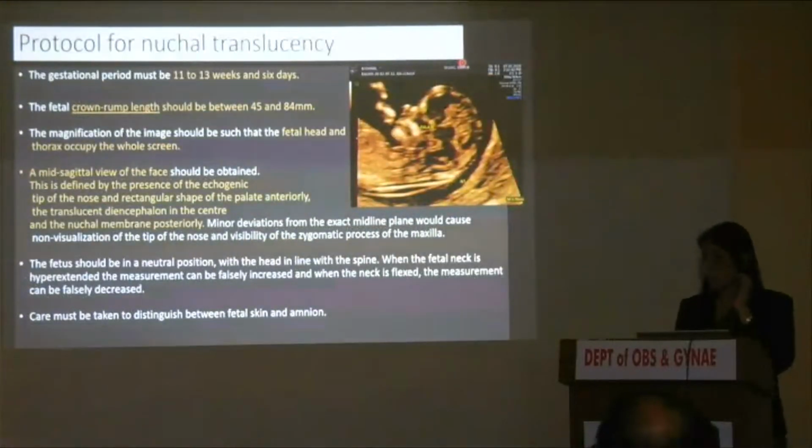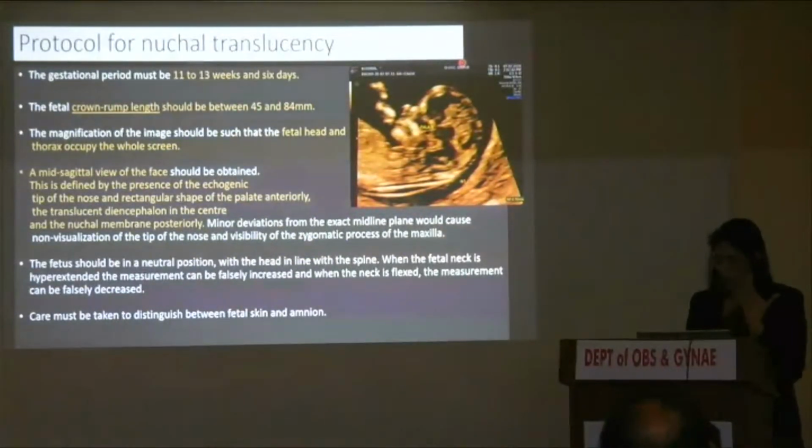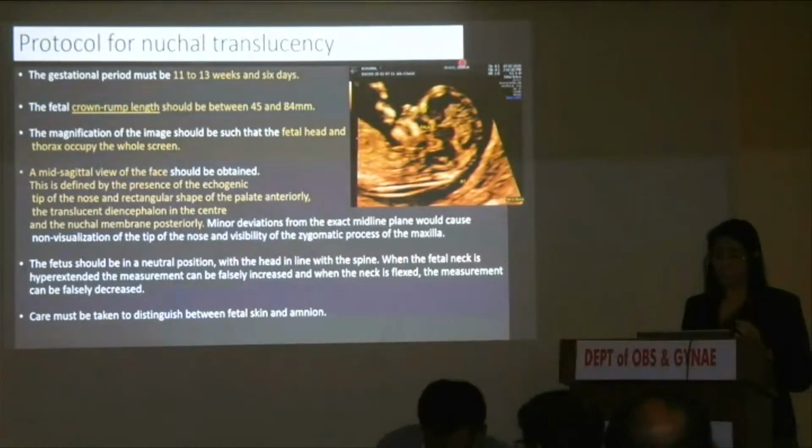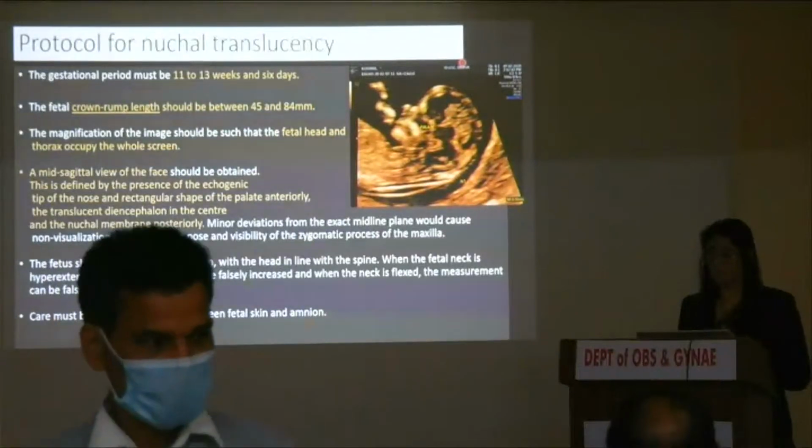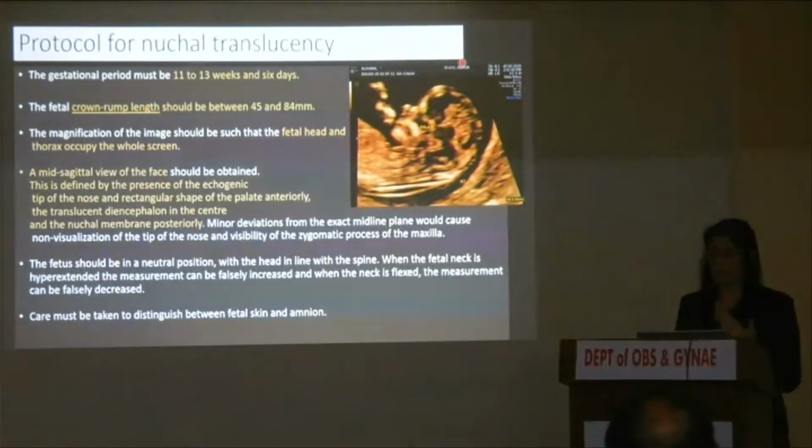So this is very important, and I urge everyone who's interested in doing fetal ultrasound that you should get yourself certified from the Fetal Medicine Foundation, because even I did. You have to submit images, know how to take the proper NT, and they give you the software where you can calculate the risk. So this is the protocol given by the Kypros Nicolaides group, which is followed the world over, that the gestational period must be 11 to 13 weeks and 6 days.